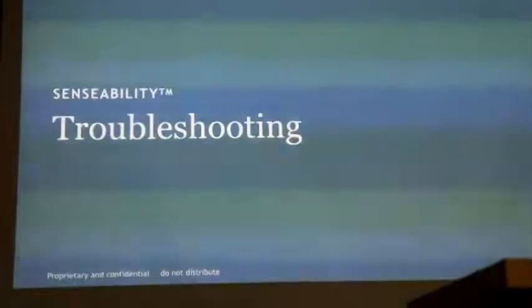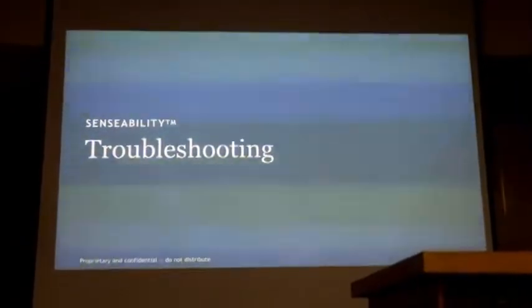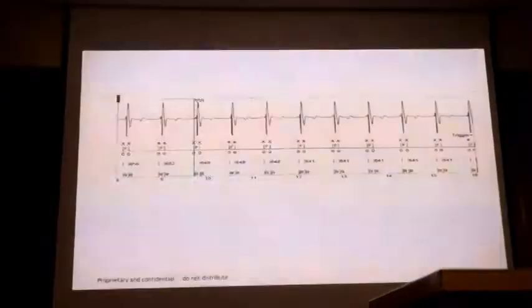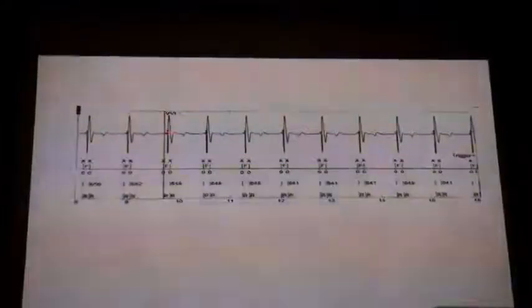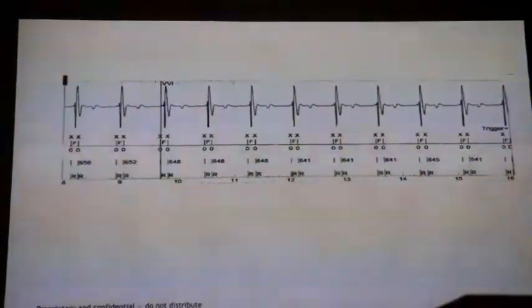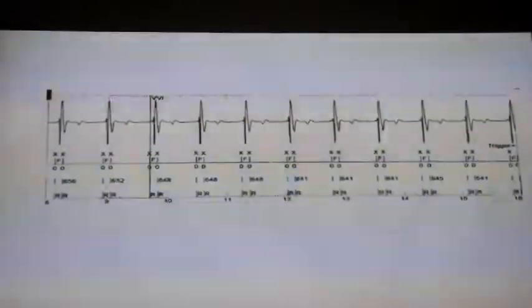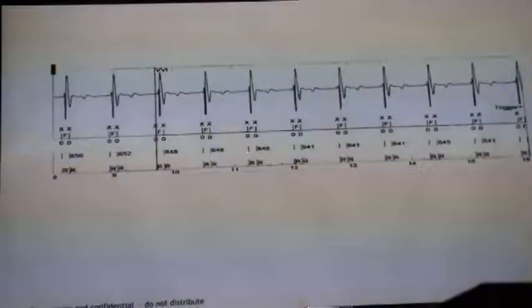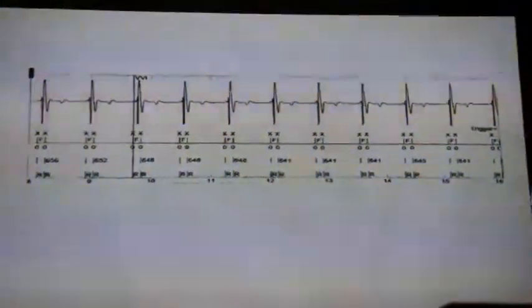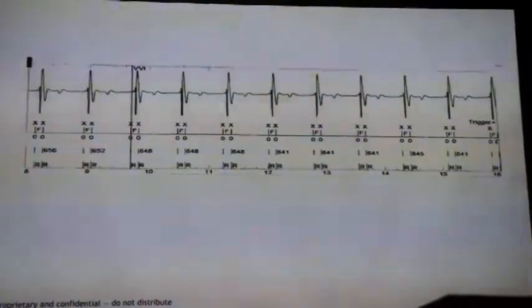Okay, so some troubleshooting of sensing, right? This is what we all love, isn't it? This is what doctors love. Give them some trouble, get them to fix it, right? Okay, so here we have a ventricular defibrillator lead sensing. So this is double counting, double R wave sensing. We've got a marker here, and the signal is seeing it twice. If this is an implant, we want you to move the lead. This was not an implant.